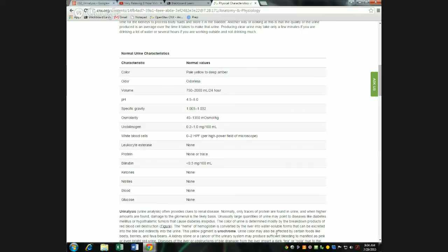Infection. Because of what? What is the sign of infection? Pus, white blood cells. So if we were to take some pus and pour it into a sample, it would get cloudy. Okay. I always kind of wanted to try this. So I have here a chai latte, which is not exactly pus color, but it's a little bit close. And so I just wonder what happens if I pour a little bit of that into the sample.